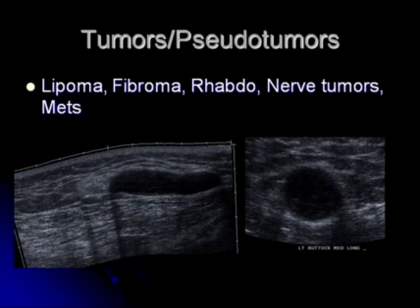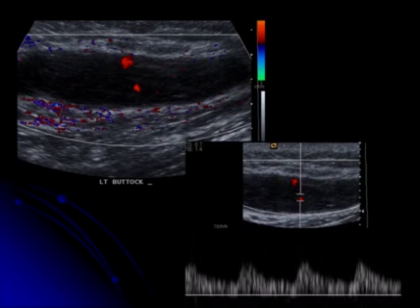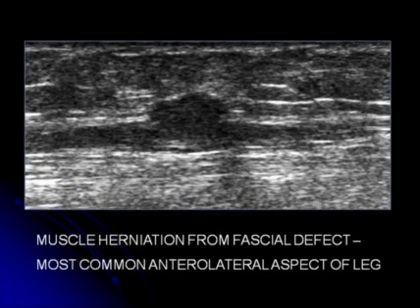While investigating the muscles, multiple incidental tumors or pseudotumors can also be visualized. Going in depth for each one is beyond the scope of this talk, but it is important to differentiate between lesions that are solid and those that are cystic. Here is a hypoechoic, well-defined lesion showing a little through transmission, initially concerning for a hematoma. On color Doppler examination, there was internal vascularity, consistent with a solid tumor. This is an image of a muscle herniation from a fascial defect — a pseudotumor.